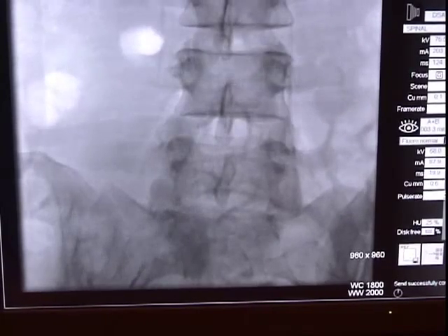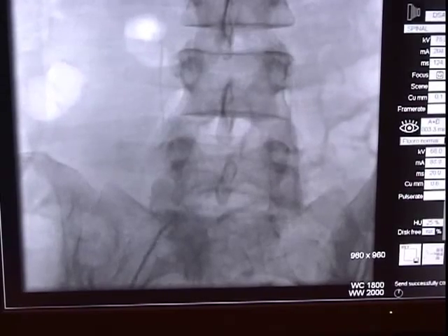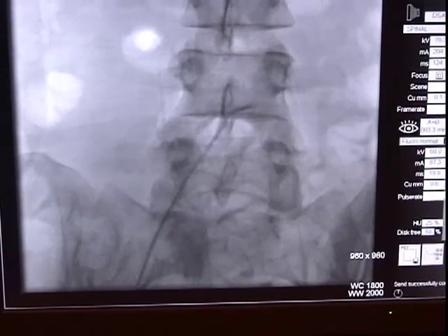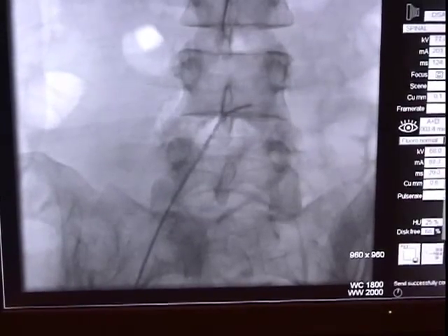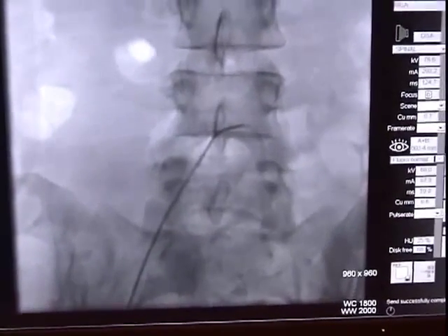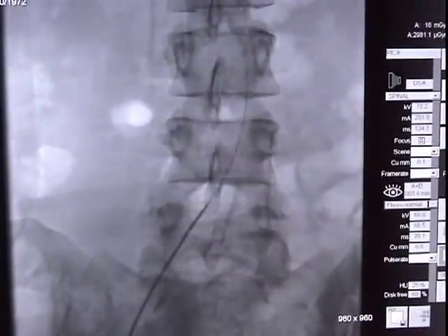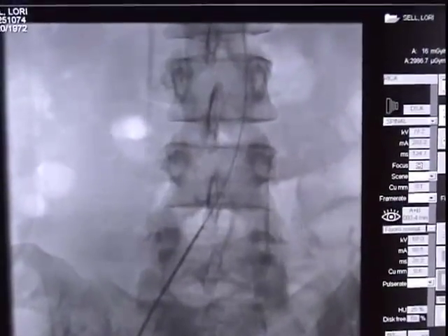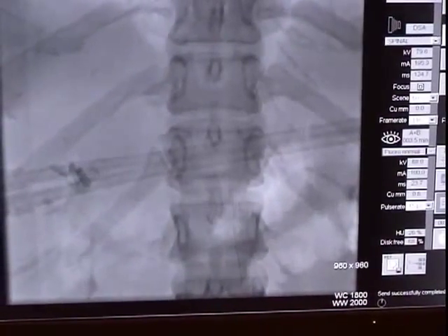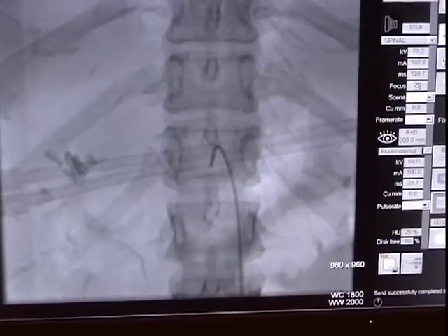Here the COBRA catheter, shown previously, is being advanced. It simply has a different shape. In some patients, one catheter is used, and in others, another is used, or sometimes a combination of the two, depending on the anatomy.